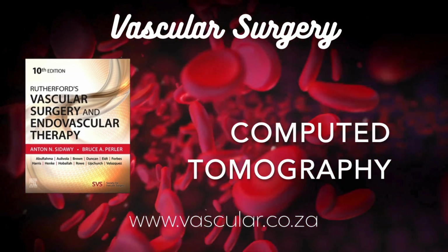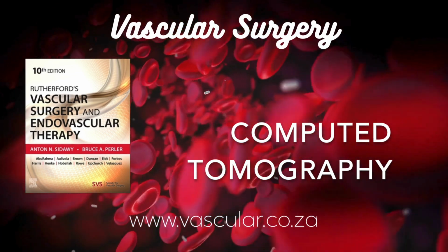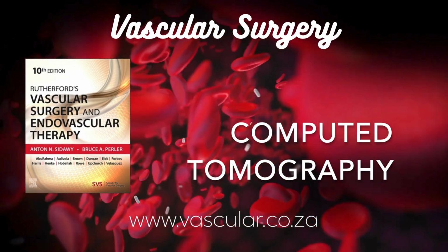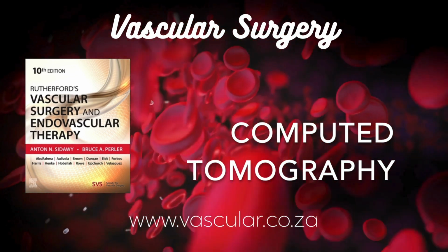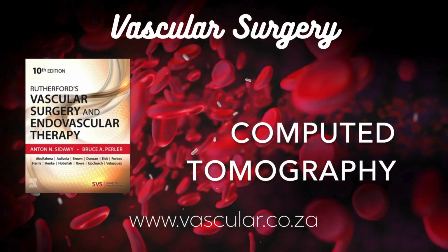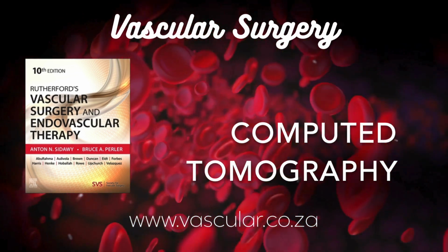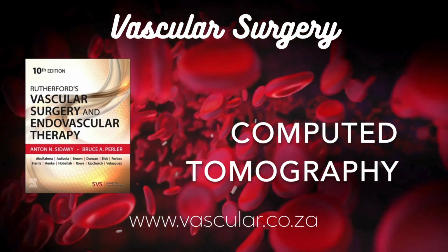And MAs. MAs, milliampere seconds, is about the quantity of X-rays. More X-rays, meaning higher MAs, reduces image noise or graininess, giving you a smoother picture. But more radiation dose. Exactly. It's a direct trade-off. So you want the MAs high enough for a good quality image, but as low as reasonably achievable, the ALARA principle, to minimize dose. KVP and MAs are linked. Changing one often means you adjust the other.